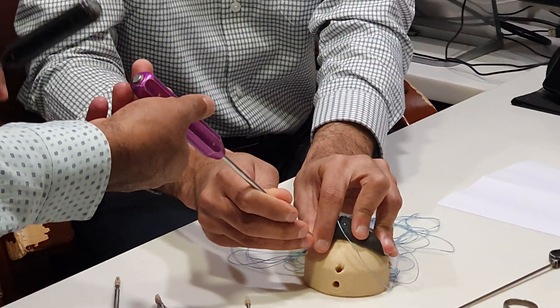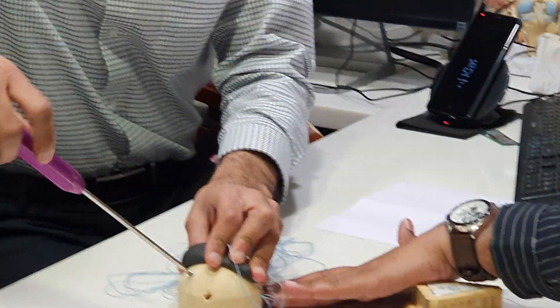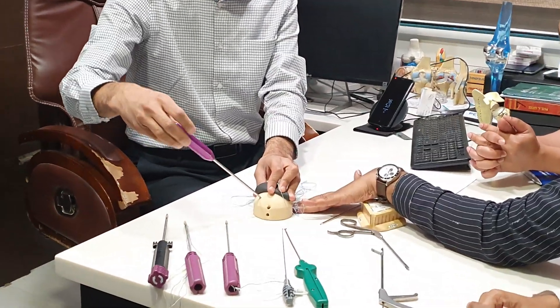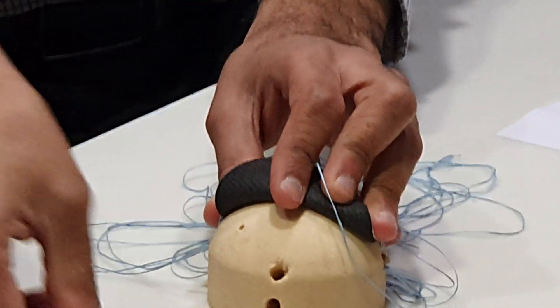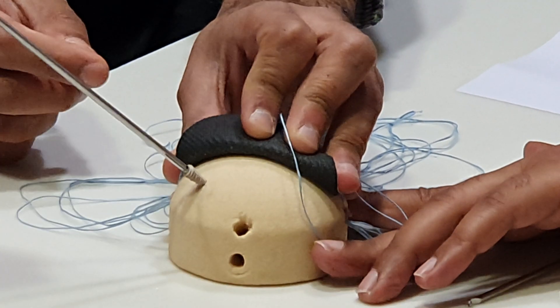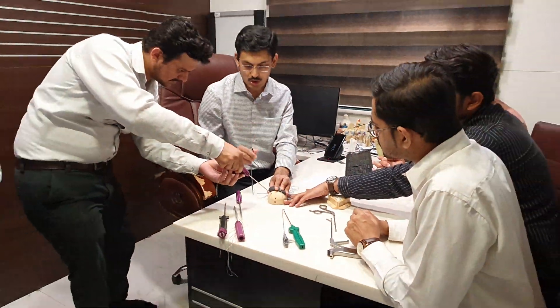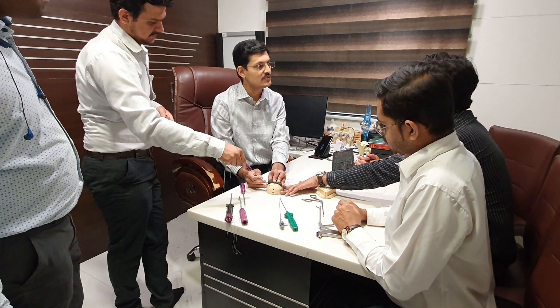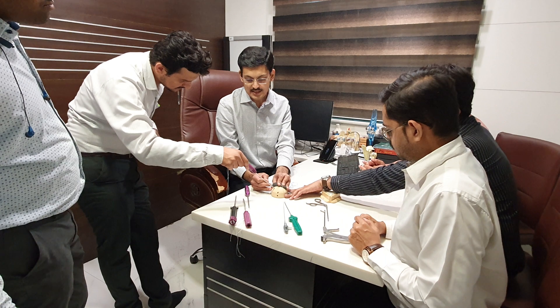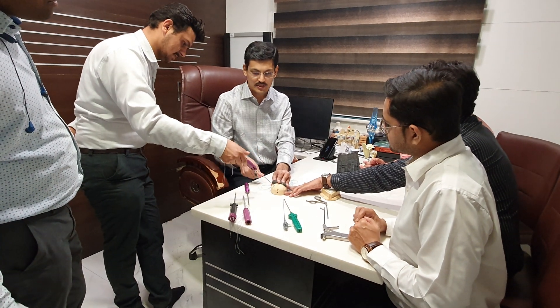Tap it in repeatedly until it is seated, then screw it nicely. You have to go up to the cortical surface. The trick here is you should not go beneath the cortex, because the best fixation is achieved at the cortex level. You should not be proud and you should not be too deep — you should be flush with the level of the cortex, as the cortical area has the best bone stock for the shoulder and provides the best pullout strength.